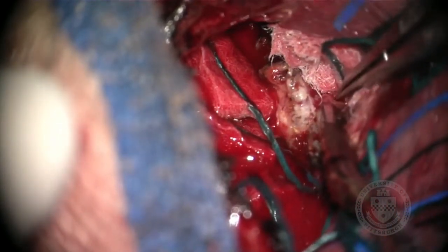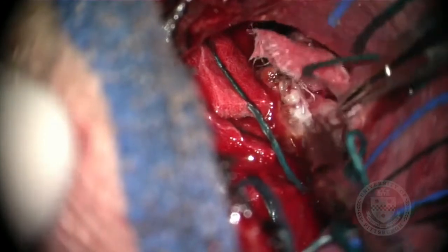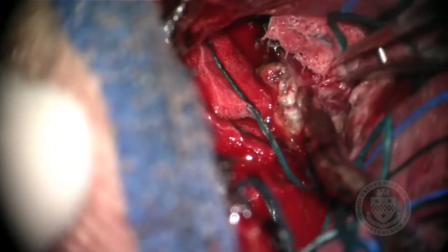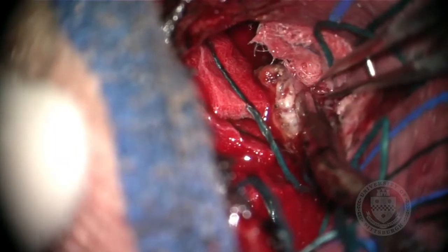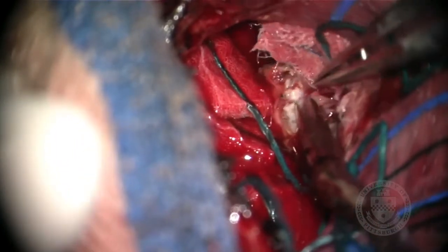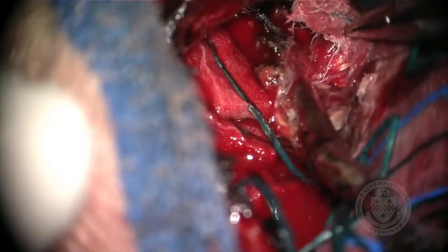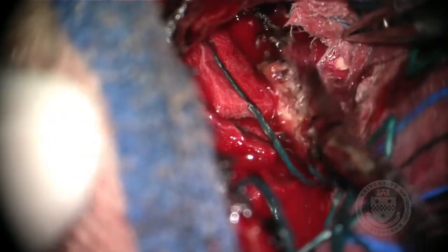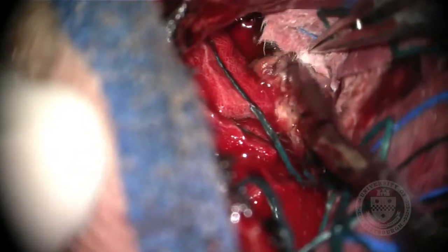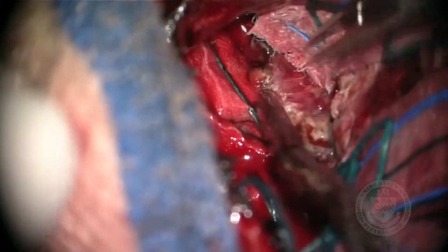The pad is protecting the brainstem. We dissect the choroidal fissure, being careful with the perforating branches from the posterior cerebral arteries. The brainstem again is being protected by the patty. We try to preserve the arachnoid of the ambient cistern to protect the vessels there.